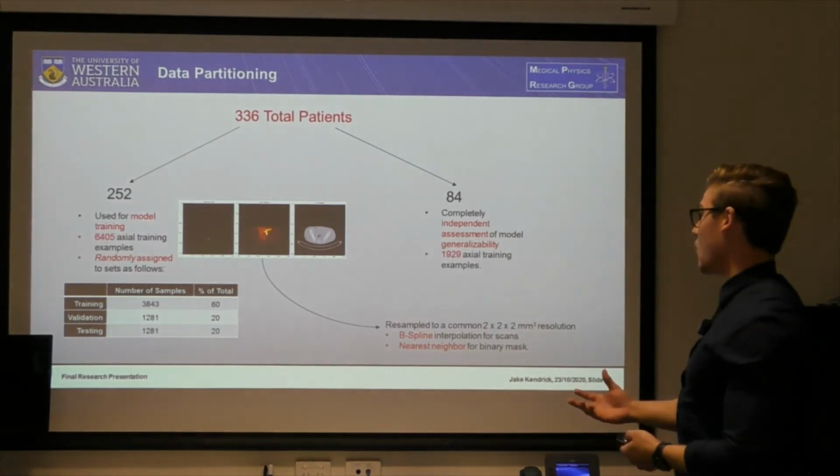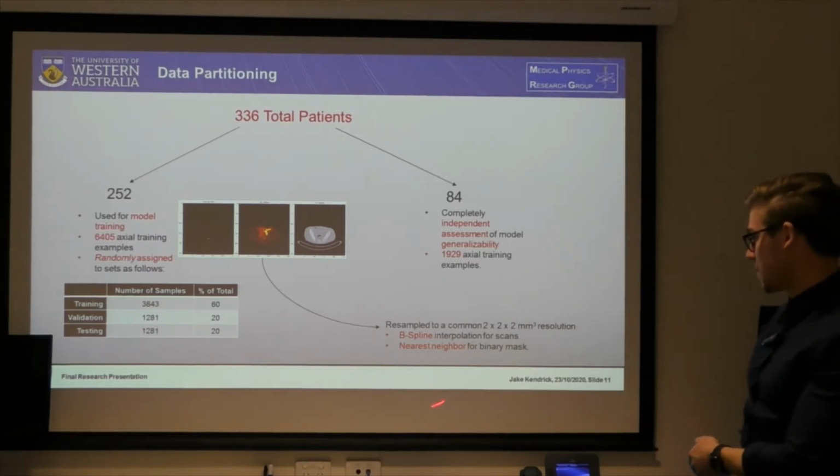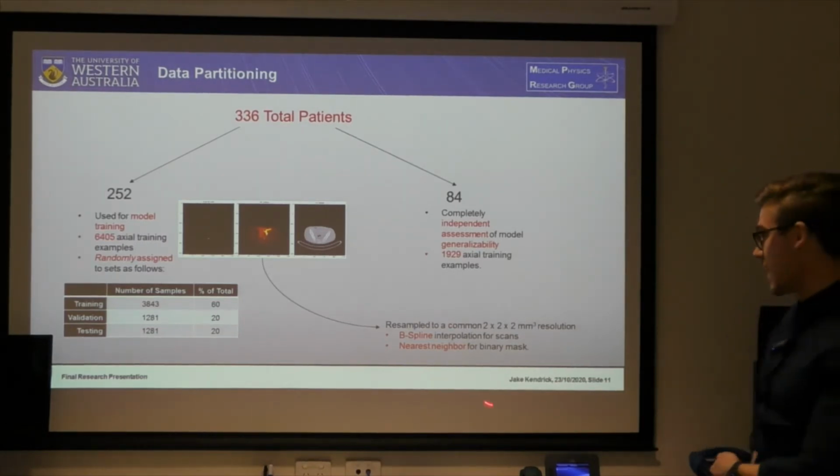Also important to note was that all images were resampled to a common resolution, 2 by 2 by 2 millimeters cubed, using B-spline interpolation for the scans and nearest neighbor for the masks.